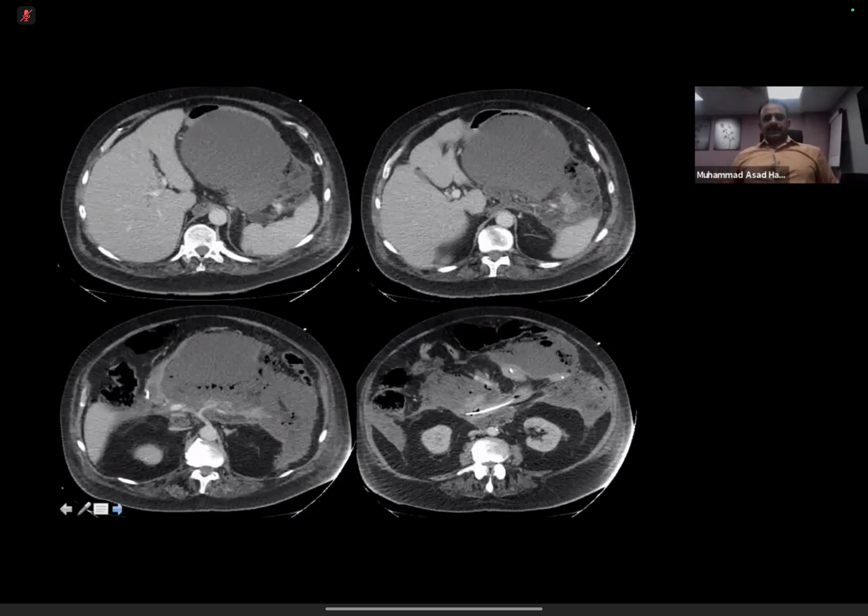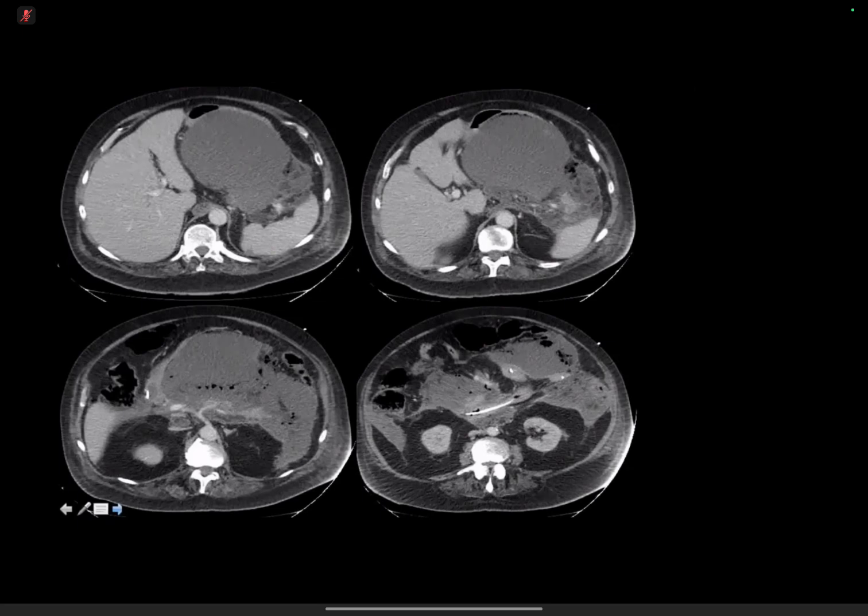Patient presented with abdominal pain, ongoing for a few weeks. Okay, so these are post-contrast axial slices through the upper abdomen, in which you can see there is a tube, which I take to be on the lowermost slice. I can see there's a tubing there anterior to the aorta. I'm trying to think whether this is in a collection that's there, but within the upper abdomen there is this distended hollow viscus, which I take to be the stomach.